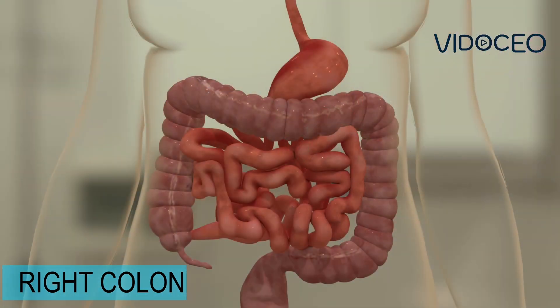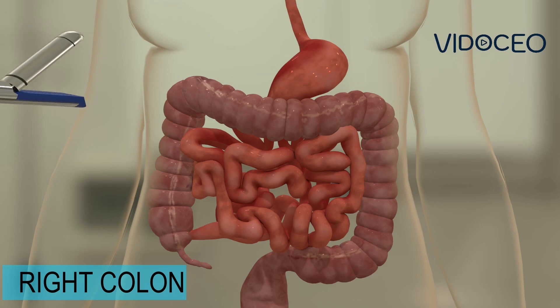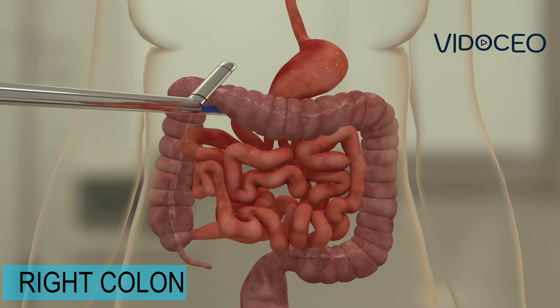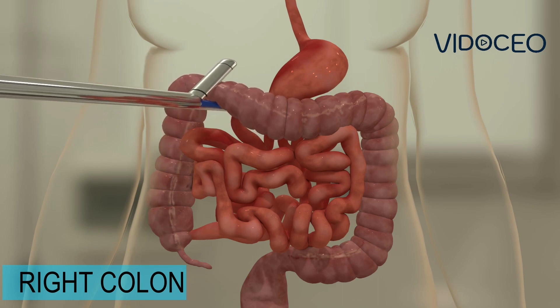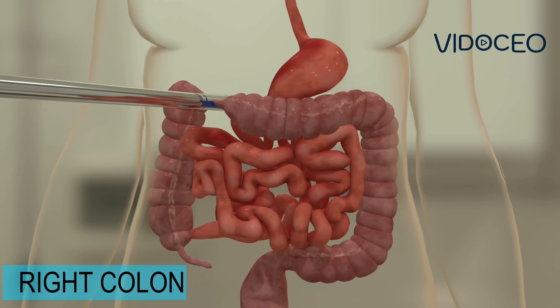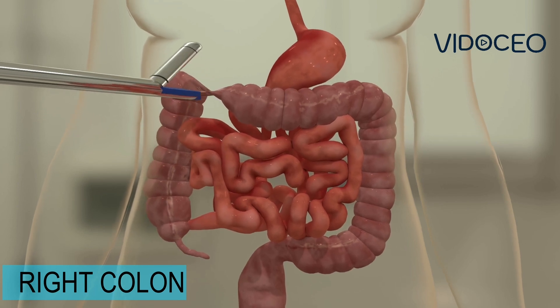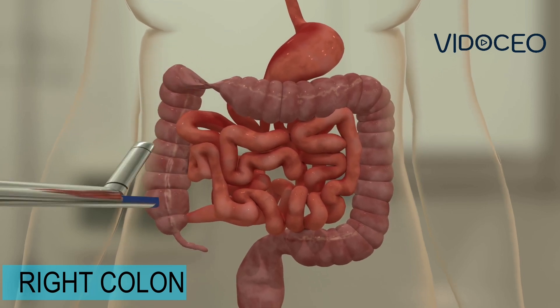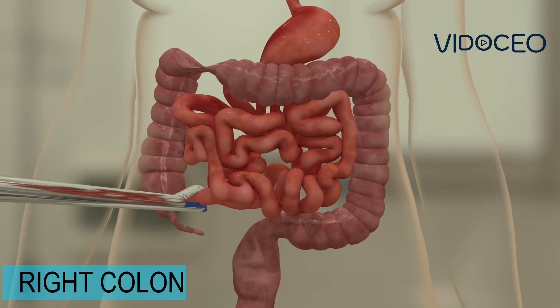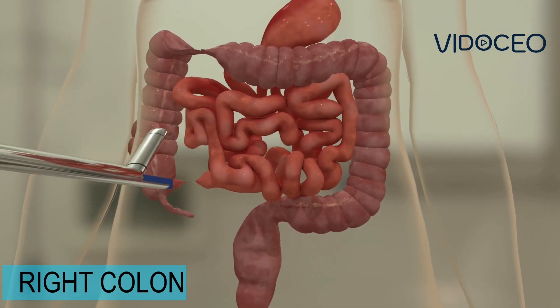The right colon is identified and freed from any surrounding attachments. The colon is divided with a stapler device near the turn in the upper right abdomen, called the hepatic flexure, since it is near the liver. The end of the small intestine is similarly divided.